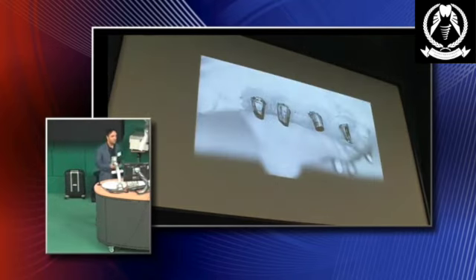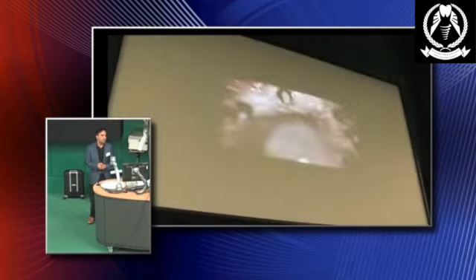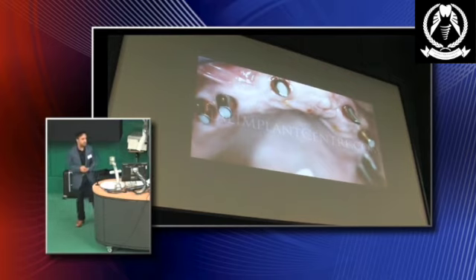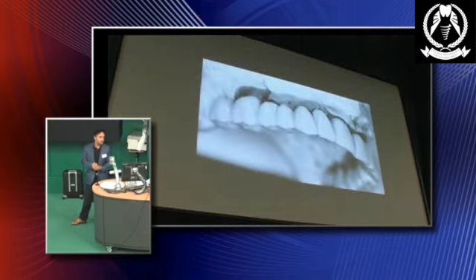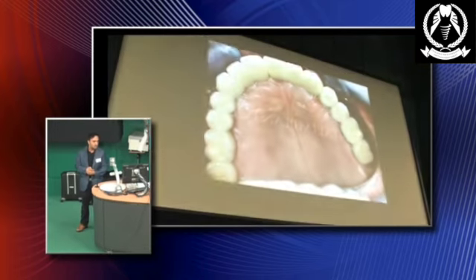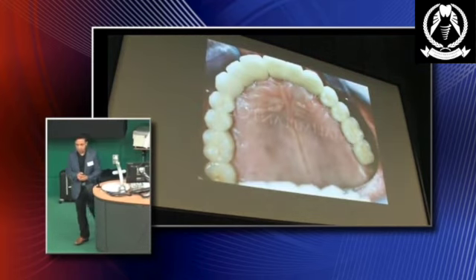The abutments were placed on a model. I just want to give you a brief overview of what these abutments look like. And we use a little bit of composite just to cover the screw holes on the abutments, on the soft tissues here. That's the ceramic bridge that was made by our ceramicists. And that's the view from the occlusal of the upper palate. And that's the bridge in position.